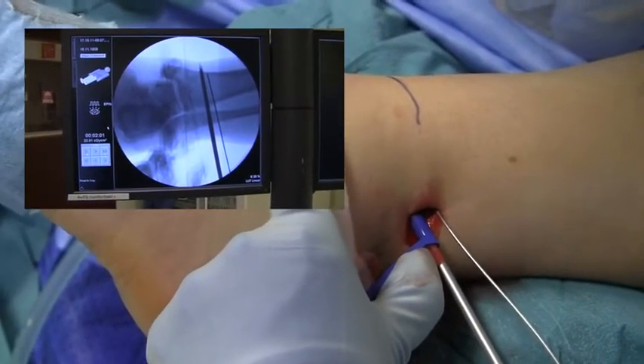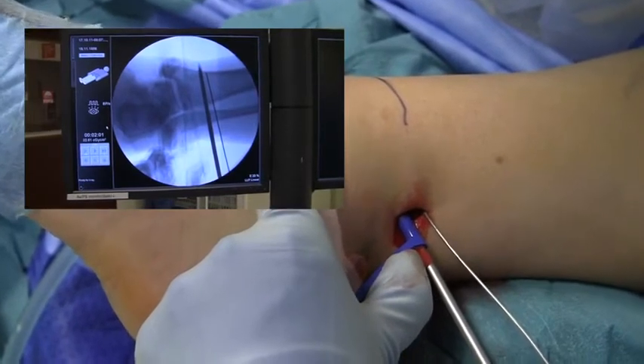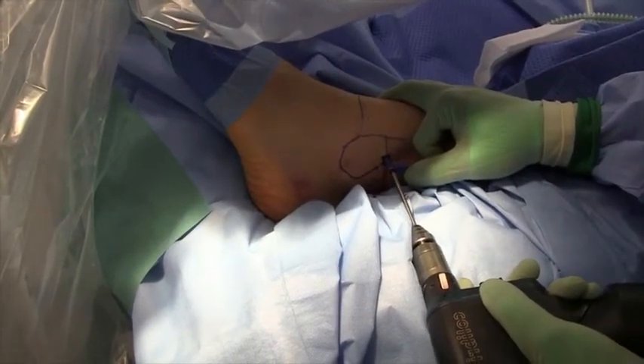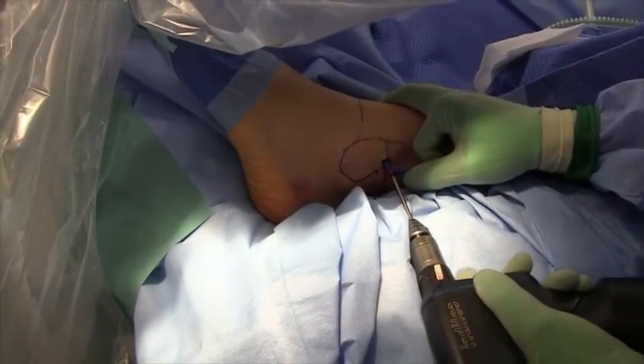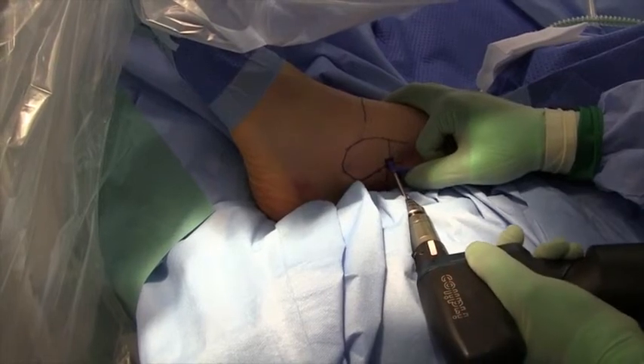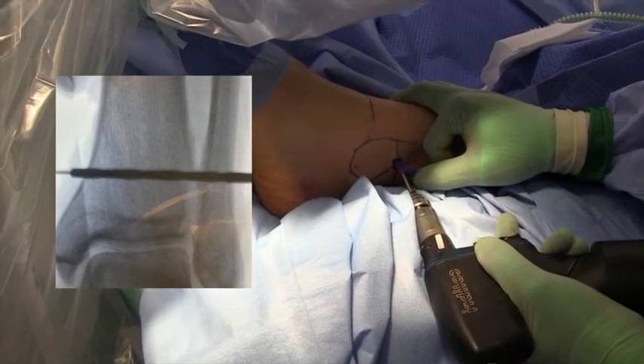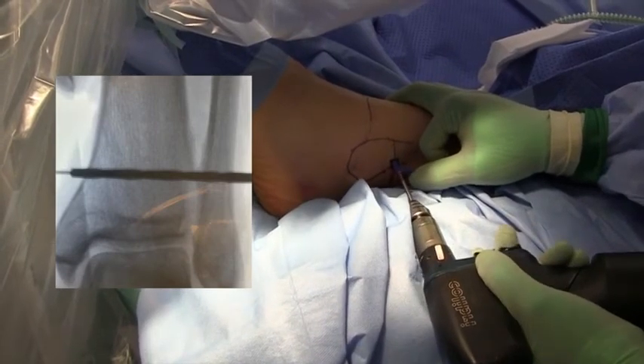We suggest centralizing the drill hole in the fibula to avoid a stress riser that could potentially increase the risk of fracturing the fibula. To obtain the wanted anteromedial direction, it is important to start slightly posterolateral on the fibula. Care must be taken not to injure the peroneal tendons.